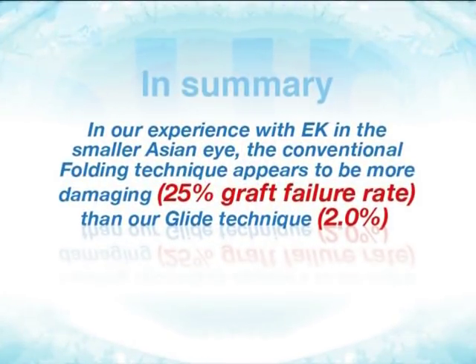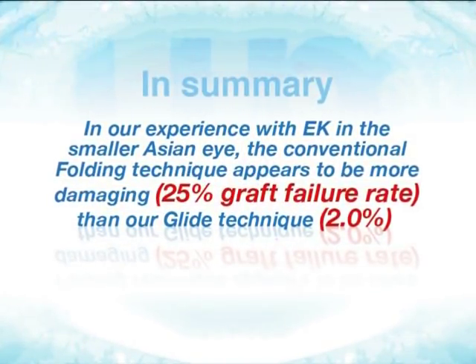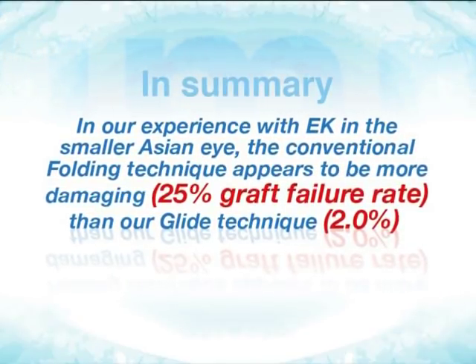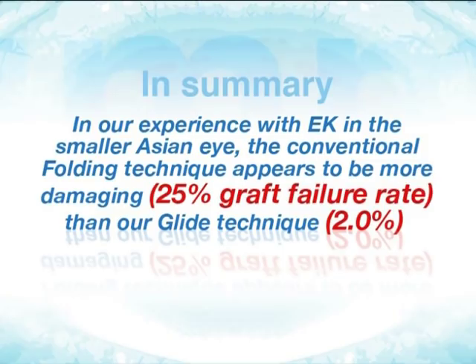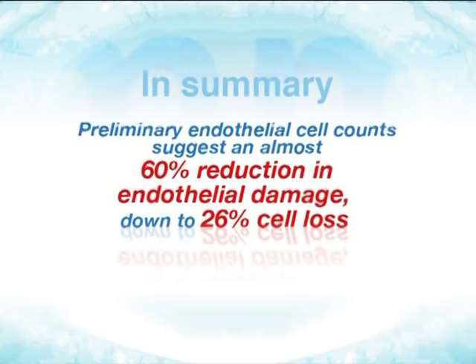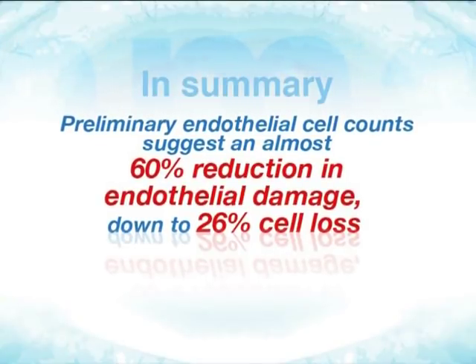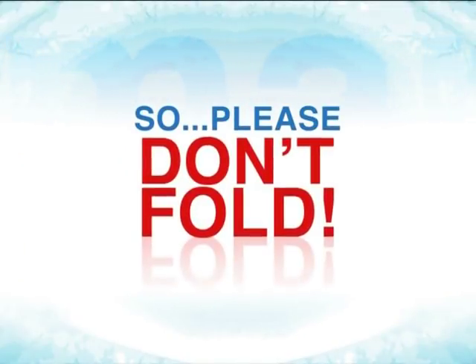In summary, folding insertion in DSAEK surgery appears to be more damaging to donor endothelium than our glide technique. And now that we no longer fold the donor, we are experiencing much lower rates of primary graft failure and better endothelial cell counts. So, please don't fold.